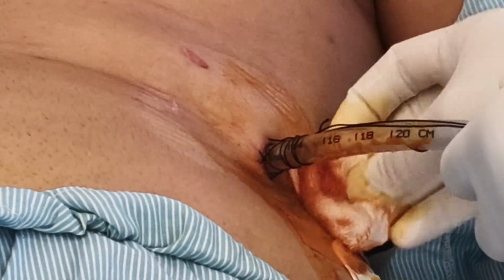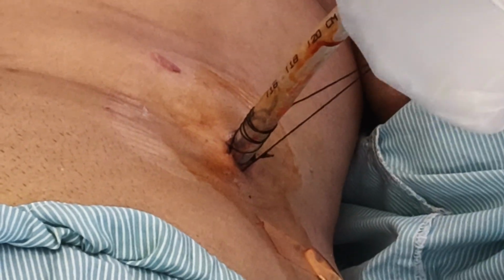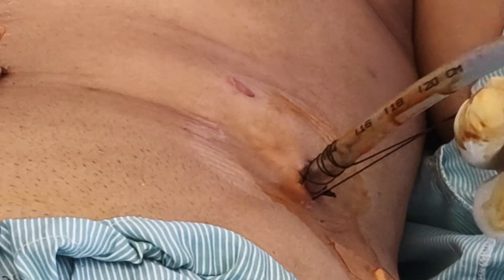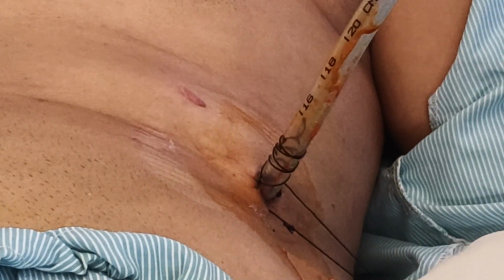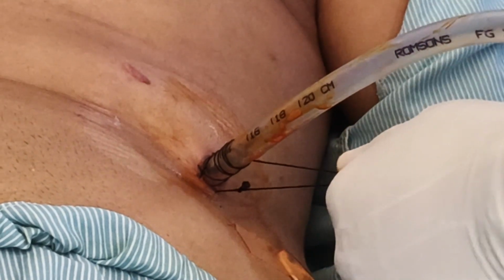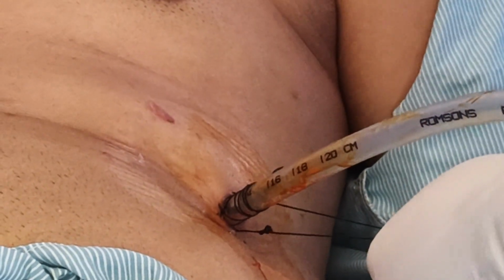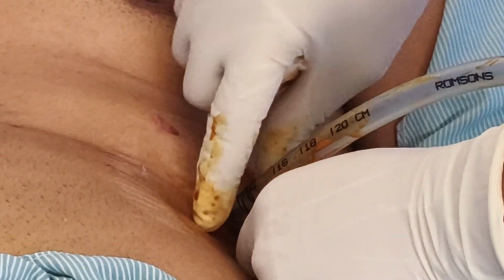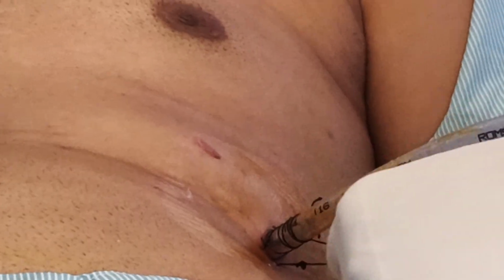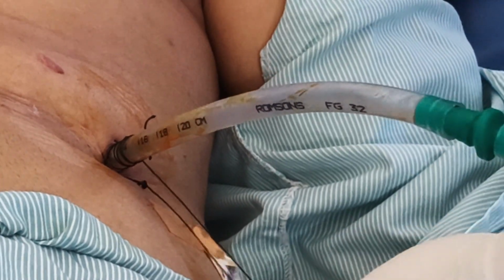I cannot tell you everything, but basically you have to find. If you zoom out, there is a box stitch taken here. If I close this box stitch, the incision will approximate. Once I remove the drain, imagine I have removed the drain, if I tie this box stitch, both the skin edges will come together. So this is my suture that I have to preserve. These ends I have to preserve. All the other things I can remove.